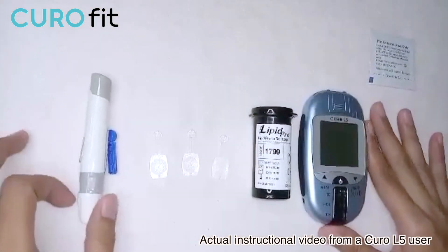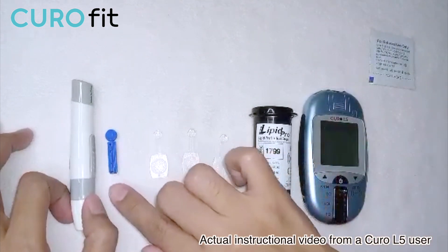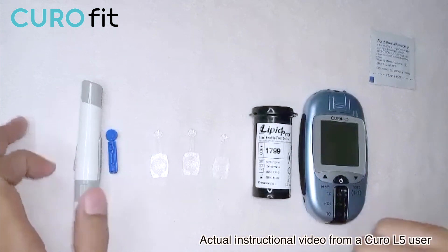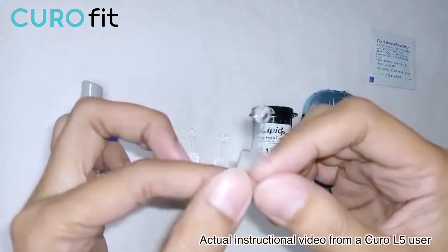To perform the test, this is what you need: the Curo L5 meter, profile test strips, the lancet, three capillary rods, and the lancing device. Why three capillary rods? It is because we will be needing three blood samples.